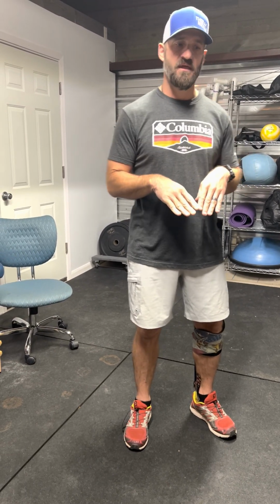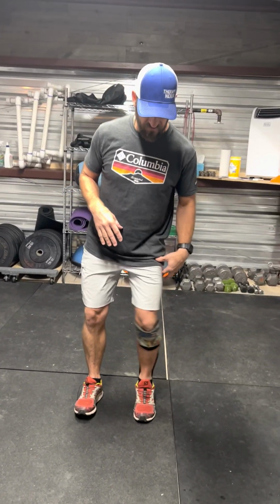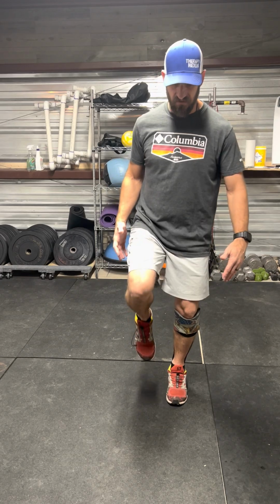Another comment that was made was about taking smaller steps when you go uphill, and that's great. I didn't say that whenever I was doing the video, but whenever you take smaller steps, you spend less time on that foot. So you don't get those compensatory bowing of the legs, like somebody else said, that genu valgum or genu varum. Varum is going out, valgum is coming in, and that's not too great to have. So you want to keep those feet straight, and whenever you take smaller steps, you spend less time on that foot to allow that to happen.